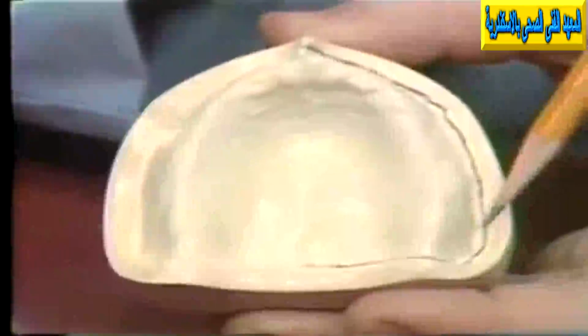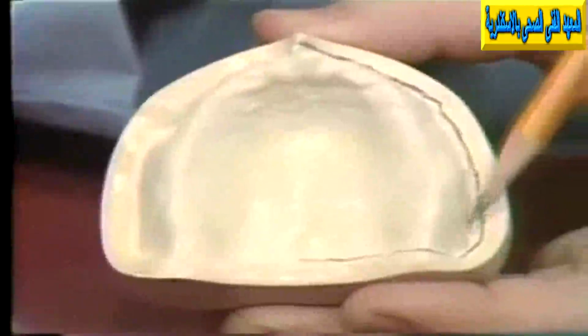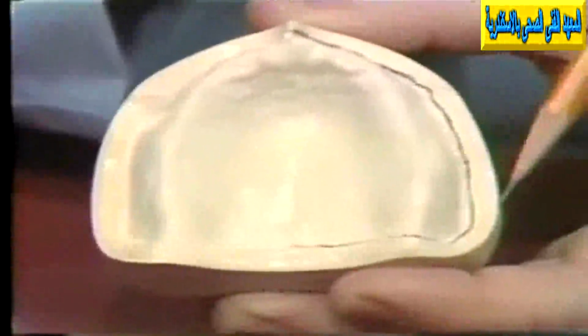Now what I have done on one side is drawn a pencil line on the inside of that landing or boxing edge, and everything from that line toward the center of the cast is actually representing tissue surfaces. And everything from the pencil line outward is artifact.